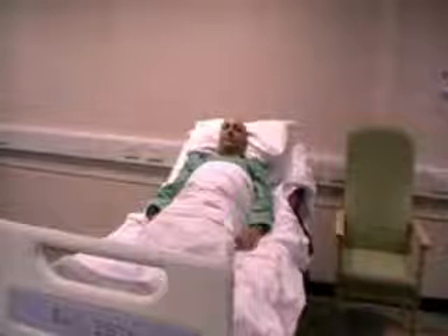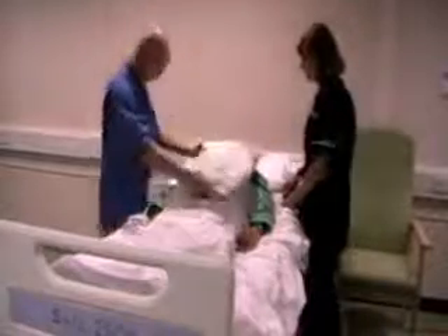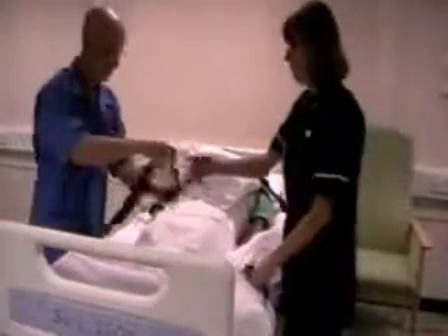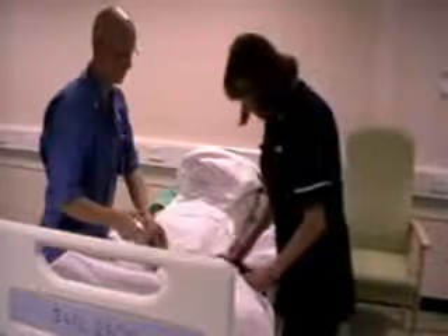Check that the ski sheets are in the correct position under static mattresses every day. For the ski sheets, place the pillow over the patient's chest. Pull the straps from under the mattress and fasten the straps across the patient's legs and chest. Pull tight to secure the patient.